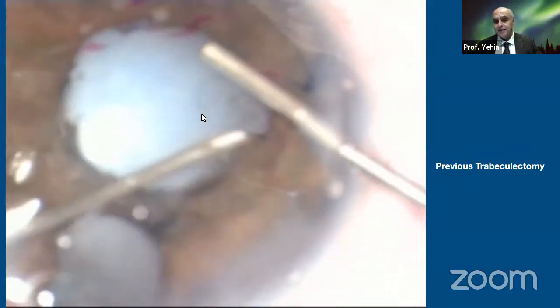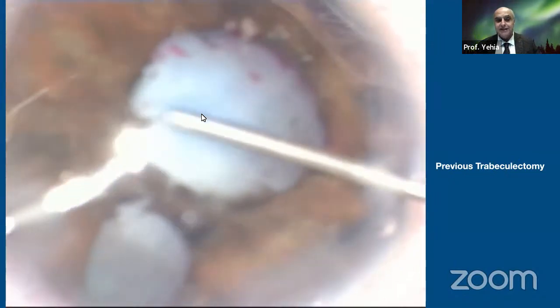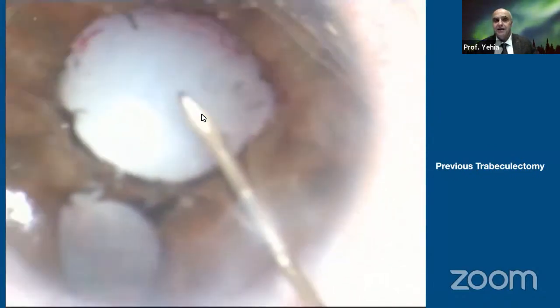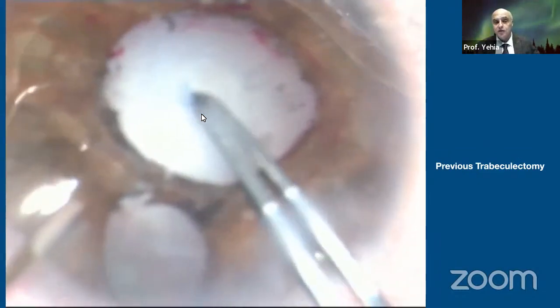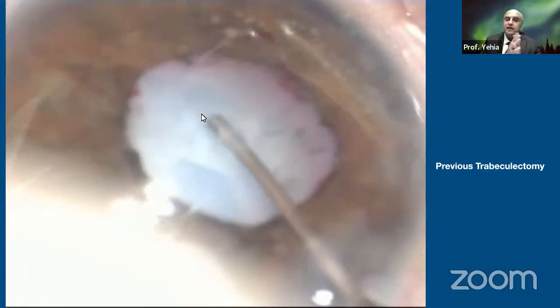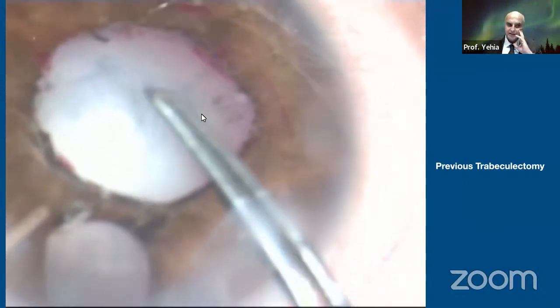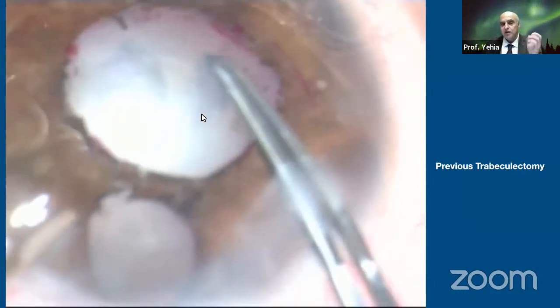You see, with the bent cystotome, you just engage the iris, taking care not to puncture the capsule, and then by injecting viscoelastic, by both traction and sweeping movement, you can dissect the synechia and widen the pupil a bit, with capsular stain. You have to be careful because in these cases you don't have complications like a normal case that you can manage easily. So you have to be very careful doing a properly sized capsulorhexis.